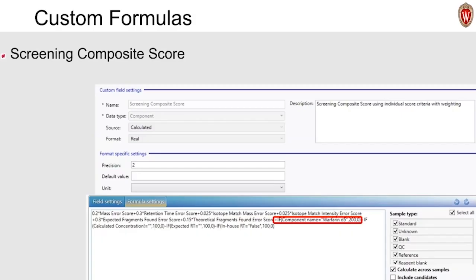Next, we use quality control materials in our run to create mini calibrations for analytes of special interest to us. The low concentration is pretty much a cutoff level. The high side is 10 times that concentration, so that we can see what the increased concentration would look like. I want to see those next because they're important to us. Add 100 points if the calculated concentration is not blank. That exclamation point equals means not equal to.